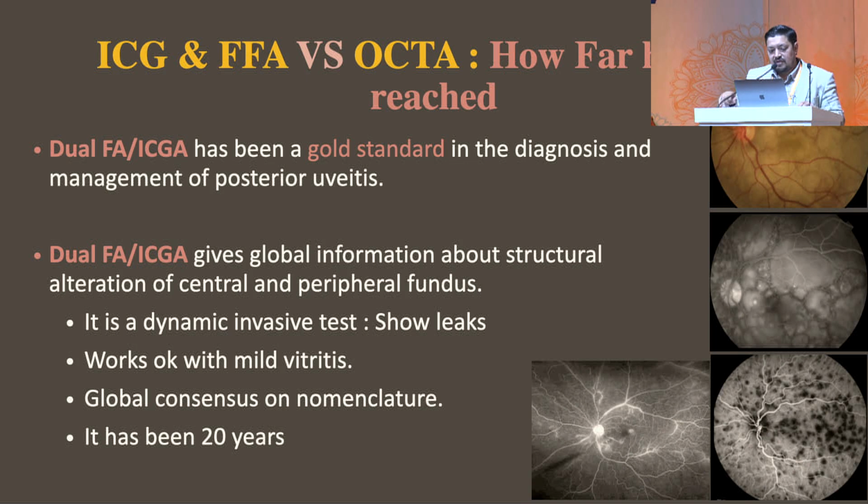So FFA and ICG have been the gold standard in the diagnosis and management of posterior uveitis. Dual FFA and ICG gives global information about the structural alteration of the central as well as peripheral fundus. It's a dynamic, invasive test, as we are all aware. It shows leak, unlike OCTA, so it can show the vasculitis very well. It works okay with patients with mild vitritis.